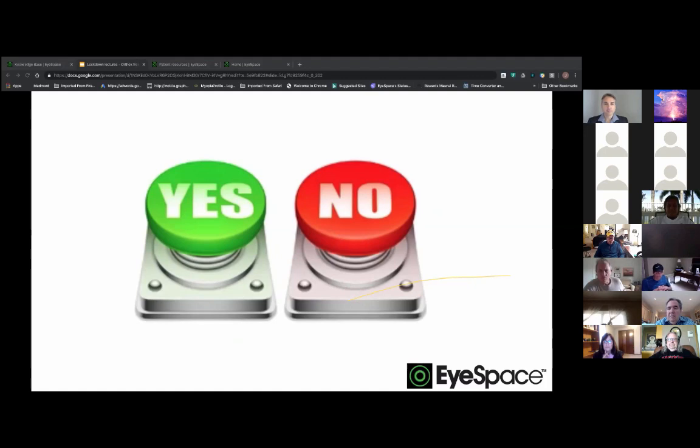It's because it's such a large topic. As you know, for example, there are some reshaping lens designs, and those who do custom design will know that they can pretty reliably get a very high myopic prescription out very quickly if a certain set of criteria are met. Whereas other cases of the same high myopic prescription can take a lot longer, due to the corneal shape, the rigidity factor of the cornea, all these sorts of things. So without overcomplicating it and without underplaying it, let's probably pick up this lecture next time with a pretty heavy topic, but we could probably start there at this slide.